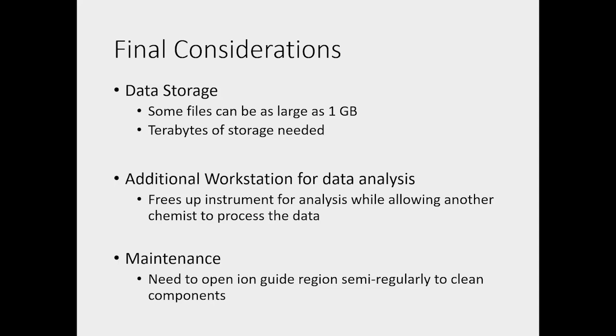It doesn't really take that long to run the samples now. If you had about 20 samples, you could run them in under 25 minutes, and then you could do the data analysis for an additional 10 minutes. So that's not really taking up too much time. But if you wanted to have a second station where you could do the data analysis part so that you do not tie up your instrument computer, you can do that as well, because we only have one DART for about 10 chemists in the Pikesville lab. So any way you can free up the instrument, that would be good.